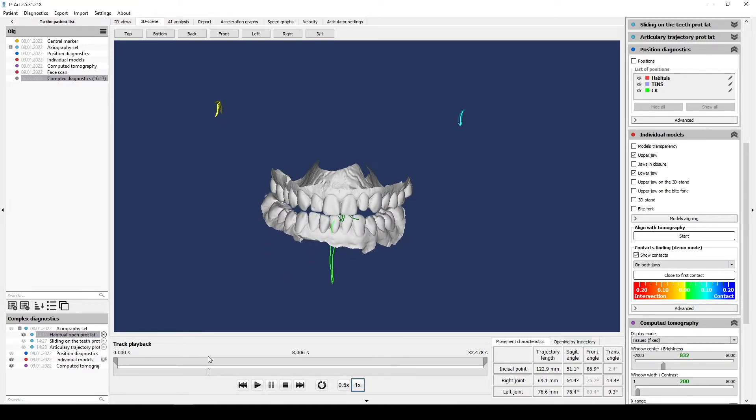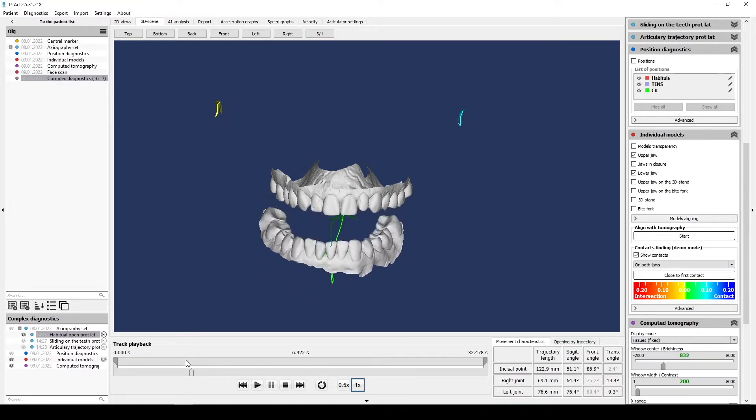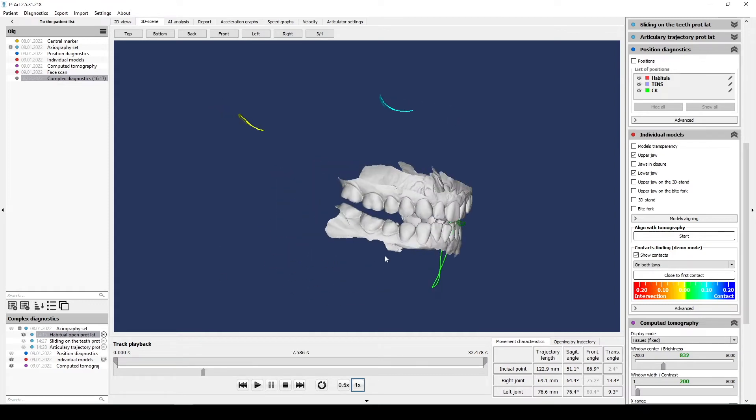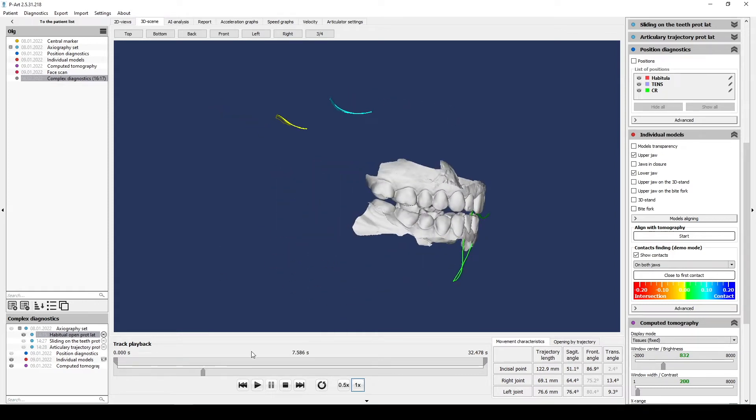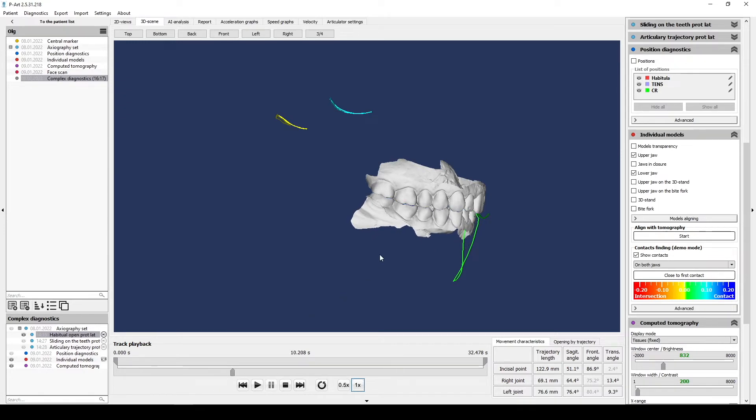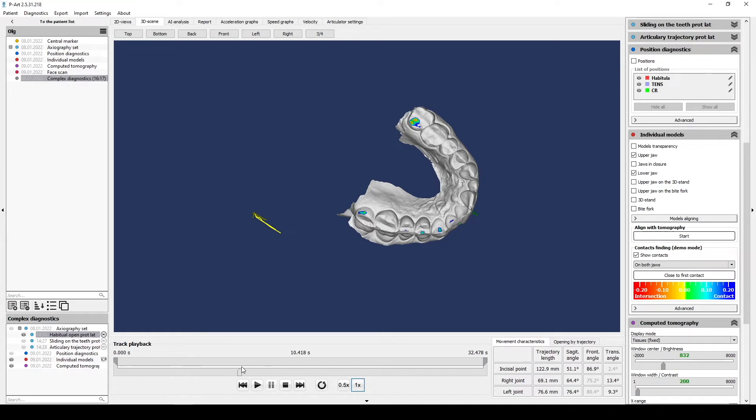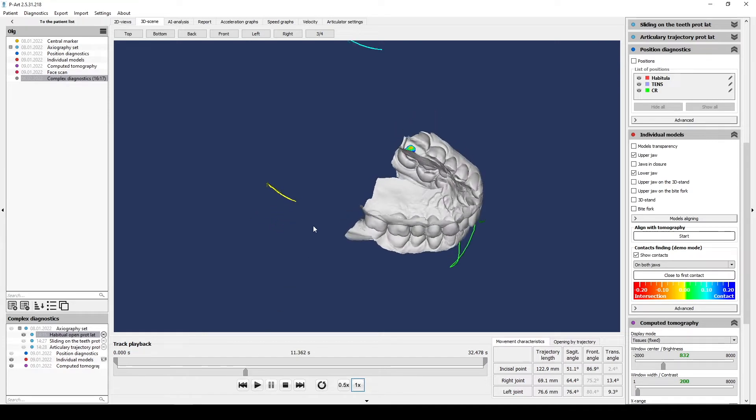For example, look at open and close movement. You can analyze it, check centration of lower jaw, the first contact or deviation, also analyze right and left joint, difference in amplitude.